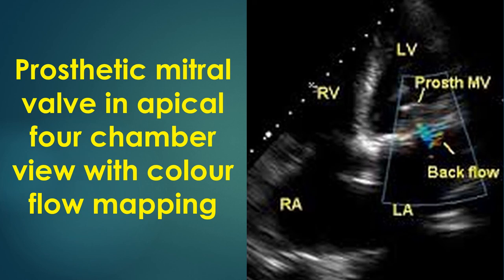Doppler interrogation from this view is useful in quantifying the transvalvular gradients. It is always good to document the gradients serially to identify rise in gradients due to pannus formation. Acute obstruction usually presents with pulmonary edema due to grossly elevated pulmonary venous pressures and calls for urgent intervention.